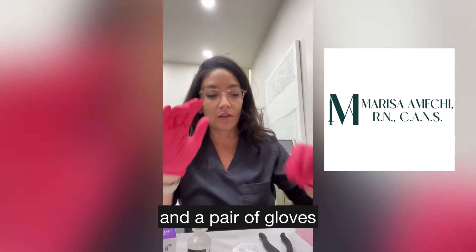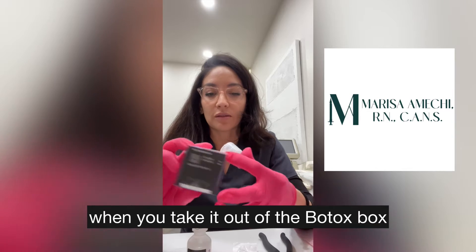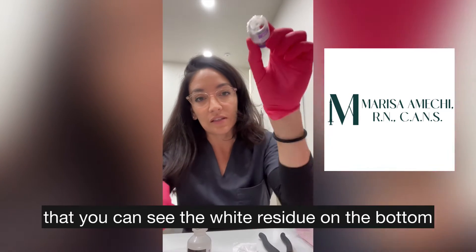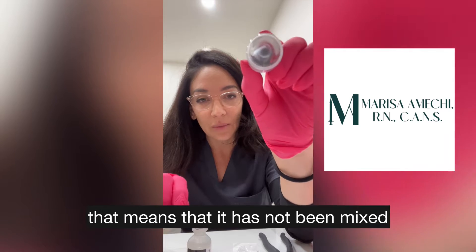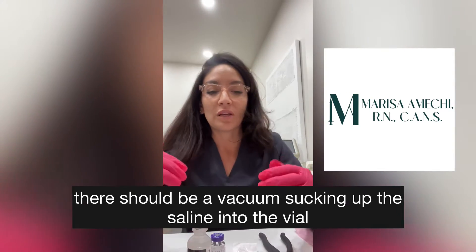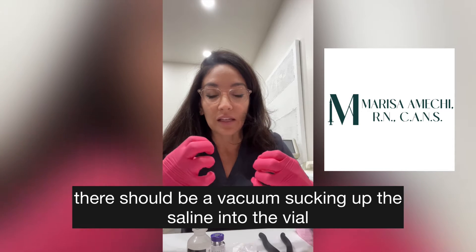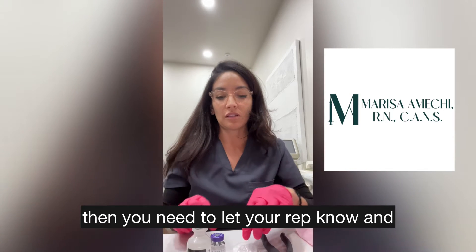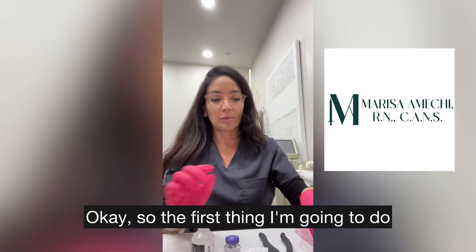You're also going to need a bottle decapper, a pair of gloves, and an alcohol swab. The first thing you're going to do when you take it out of the Botox box is make sure that you can see the white residue on the bottom — that means it has not been mixed. Once you mix it, there should be a vacuum sucking the saline up into the vial. If it doesn't have that vacuum seal, let your rep know and don't use that vial.